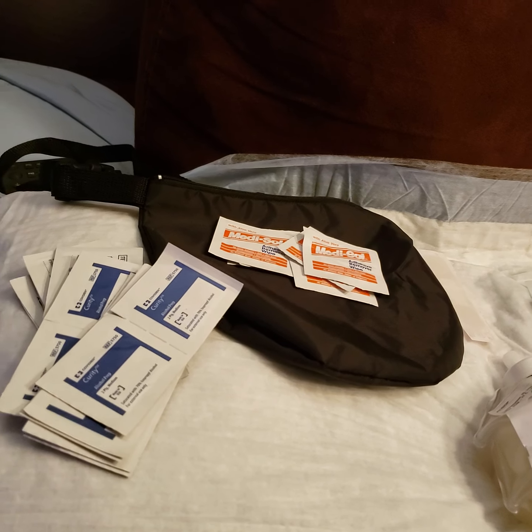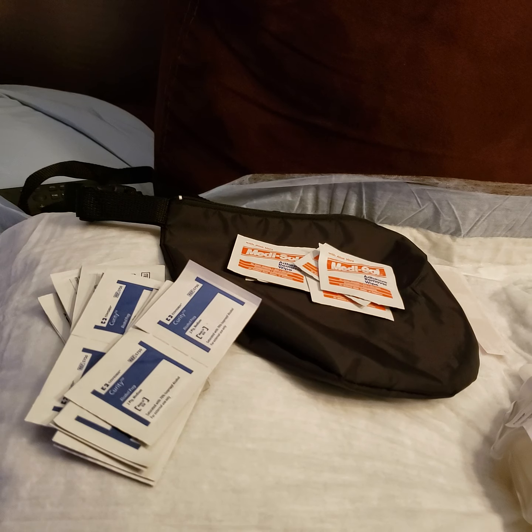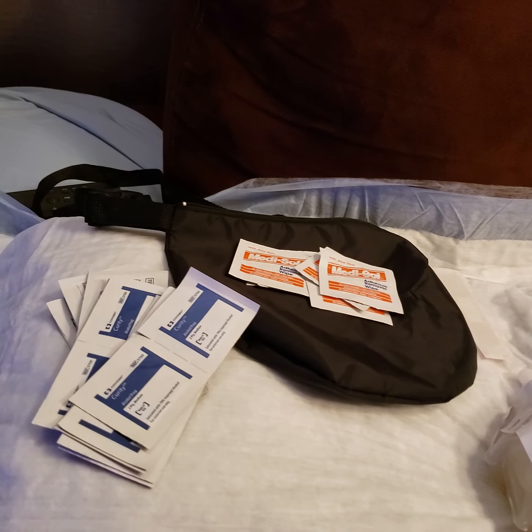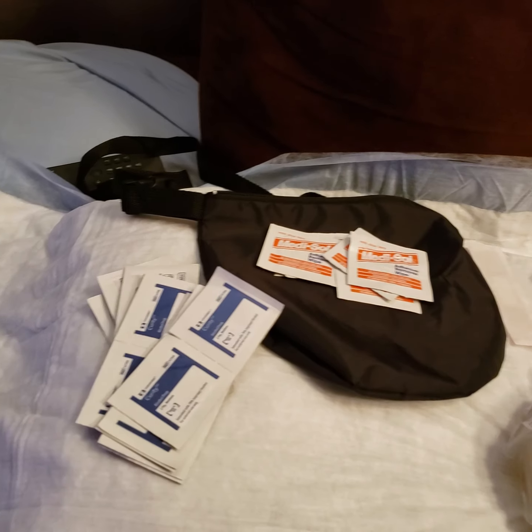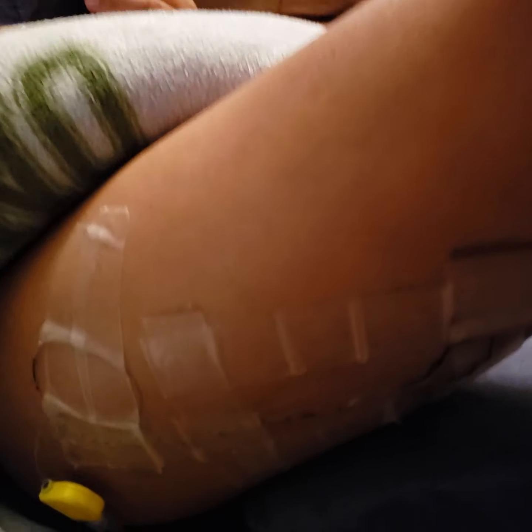Hi guys, today is day three post-op. My son underwent surgery to correct his flat feet and he was sent home on a peripheral nerve catheter, so we are going to remove it today. It's inserted in his thigh.